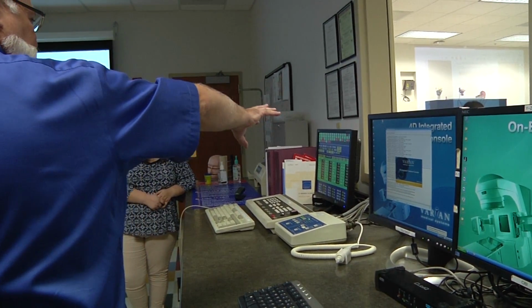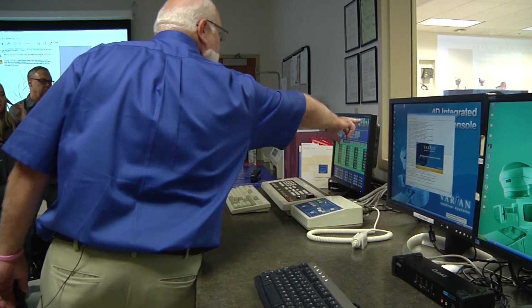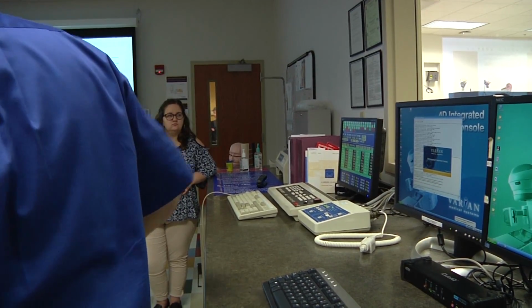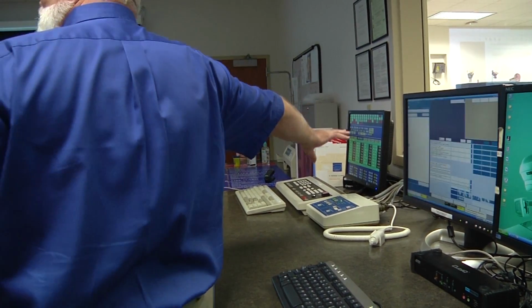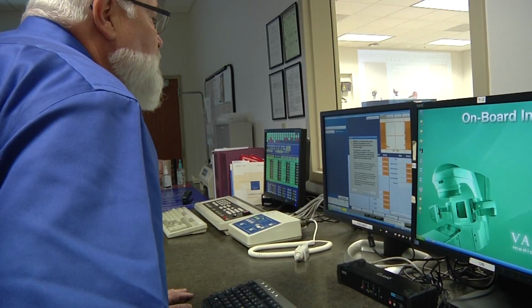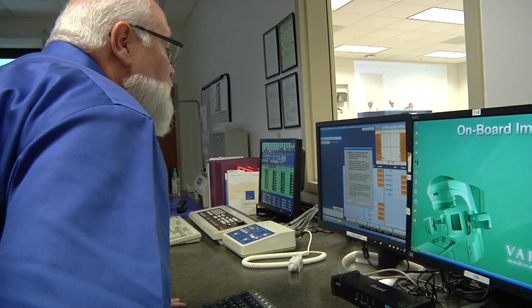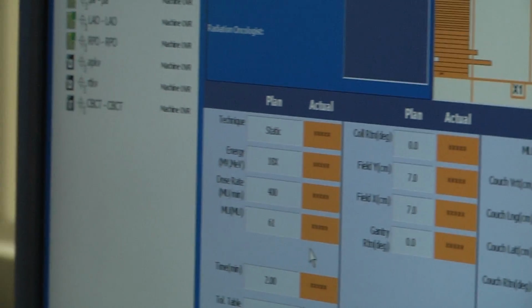So one of the things I did, I'm in service mode in the Linear, and why I did that is I needed to override flow and pump. So it's quieter in the room. I turned off the pump breaker so you don't have that loud noise. But I can only do that in service mode. Okay, so you'd be in treatment mode, and we want to get to hyperterminal.